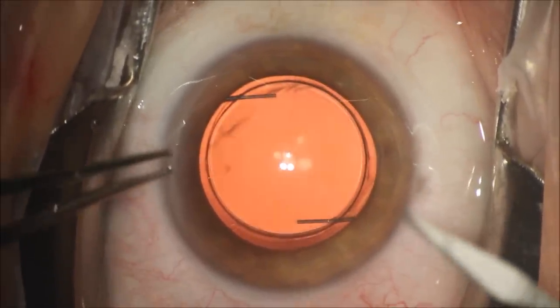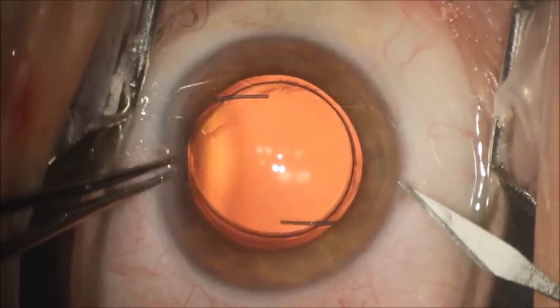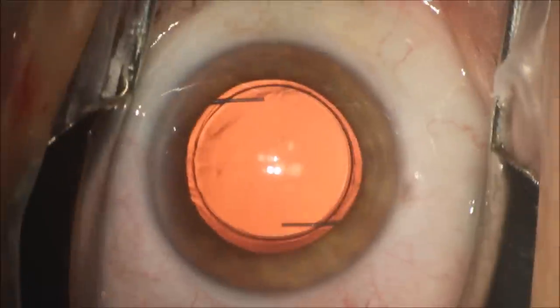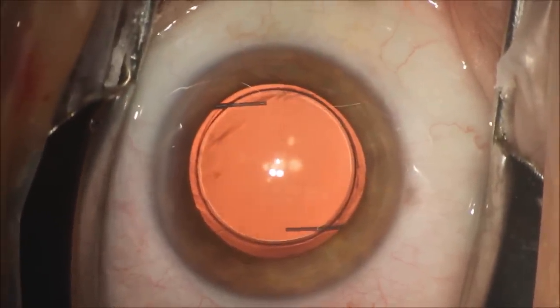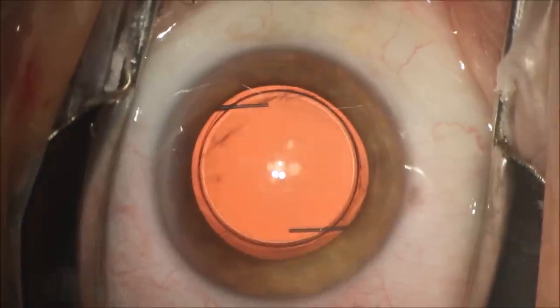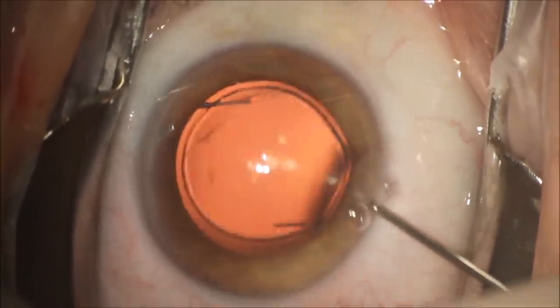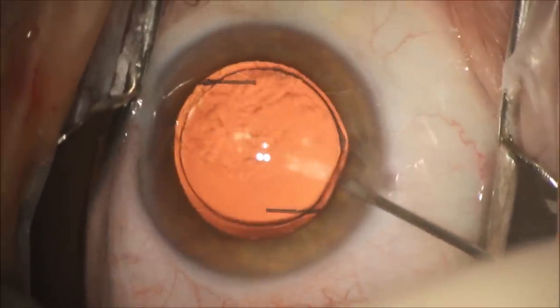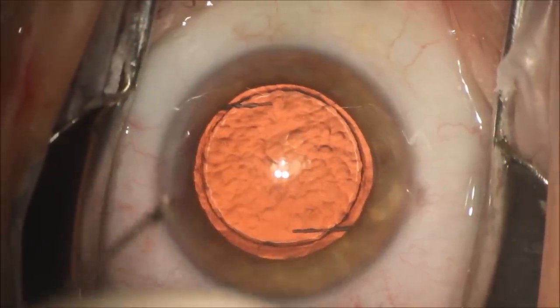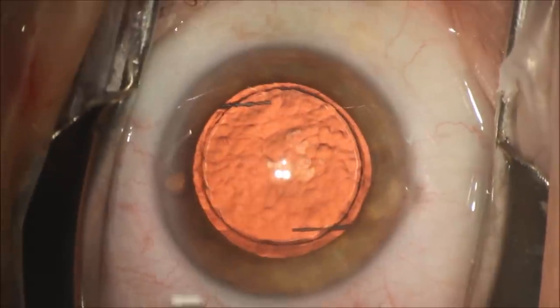You can see we made a side port incision at the superior cornea using a 15 degree super sharp blade. We're going to make one on the inferior cornea to give access to the eye via these two ports if necessary. The main incision usually is able to be opened with a blunt spatula after we inject viscoelastic into the anterior chamber. This creates space and firms up the eye and gives some resistance when we're opening a previously made corneal incision with a blunt spatula.